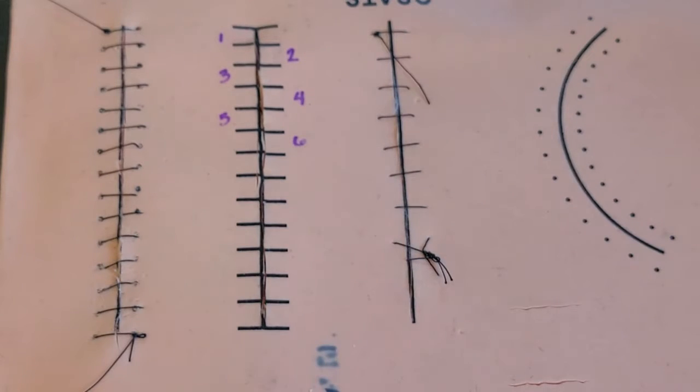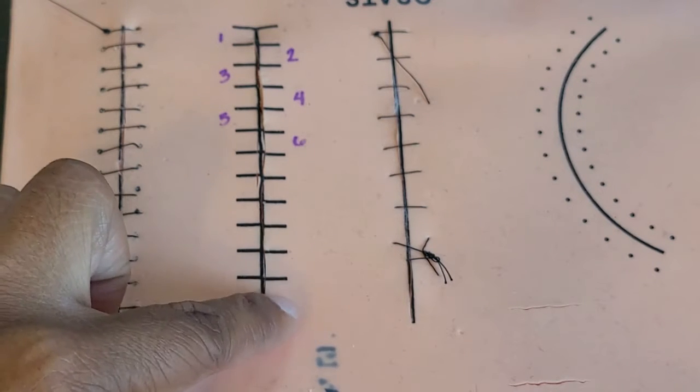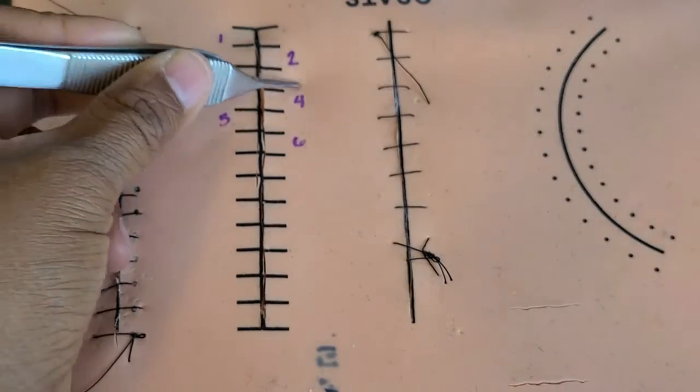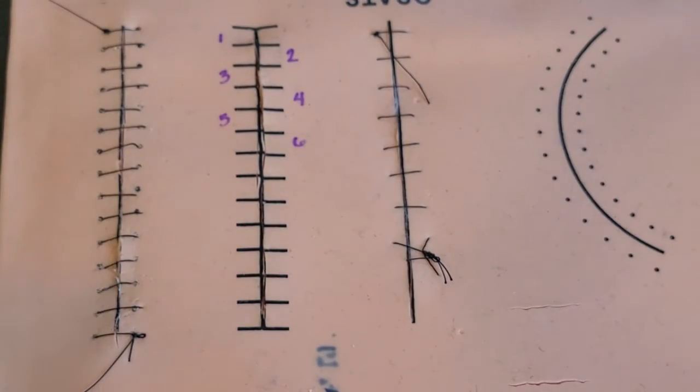The best incision on your SimVivo board that you should be practicing for the subcuticular for now is the one that has the markers where it looks like a railroad track. I numbered my incision so it was easier to show you where you should be going for each step.